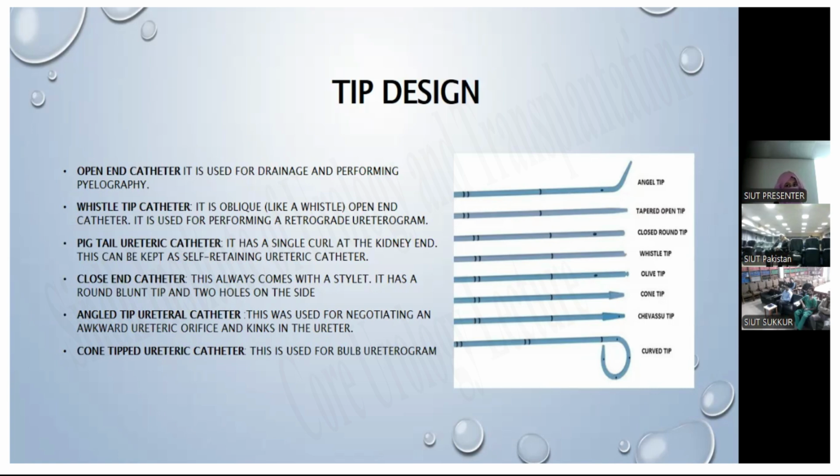Now, not in this country, but perhaps in other countries, or perhaps in our center also, we have got different dimensions of these catheters, and they are precisely used for dilatation of ureters. But we might use it for interim catheterization, not as a dilator in many of our cases.